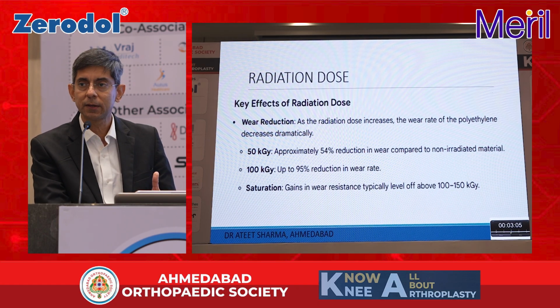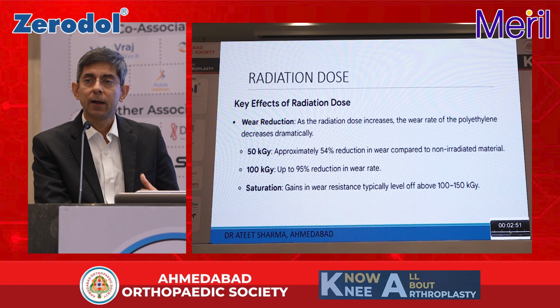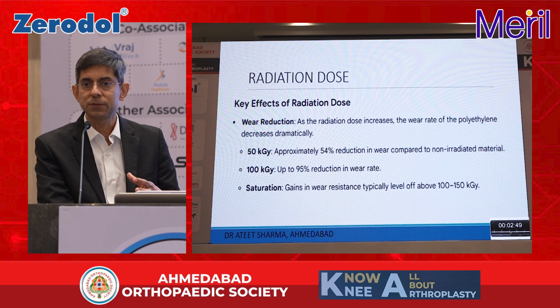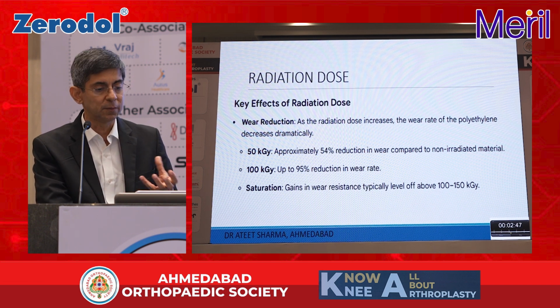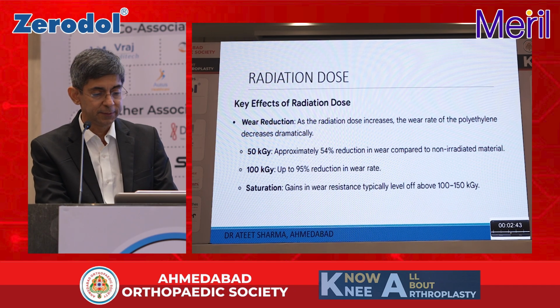So 50 kilogray is 5 megarad, approximately 54% reduction in wear, and 10 megarad is 95% reduction in wear rate. Anything above 10 megarad will typically level off wear resistance. The Attune poly which we use is on a radiation dose of about 8 megarad.